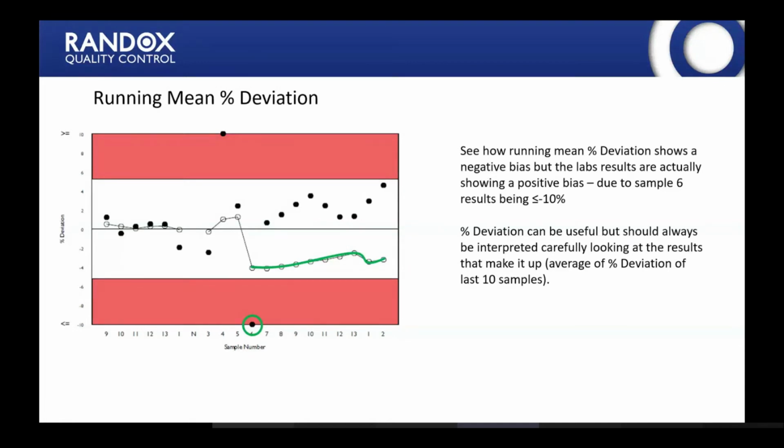So with the percentage deviations and the running means, again, Stephen had pointed this out, that one outlier result, one poor performer, can affect the running mean value. So back at the start of this chart, you can see the lab was performing well and the running mean is nice and close to the 0% deviation line. Then we have a high result and we have a low result, and we can see the shift. So we can see at the high result, the running mean goes up a bit, and then once we have this very low result, the running mean shifts back down and continues to run with a negative bias.